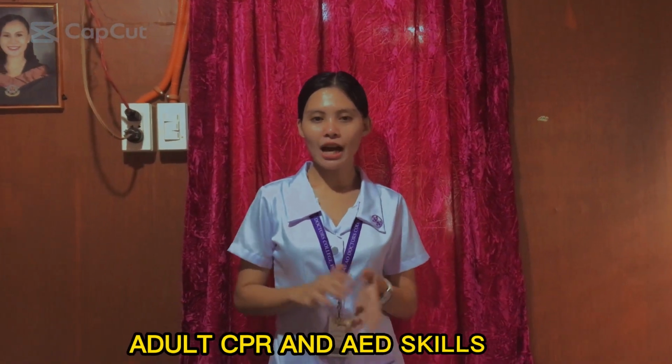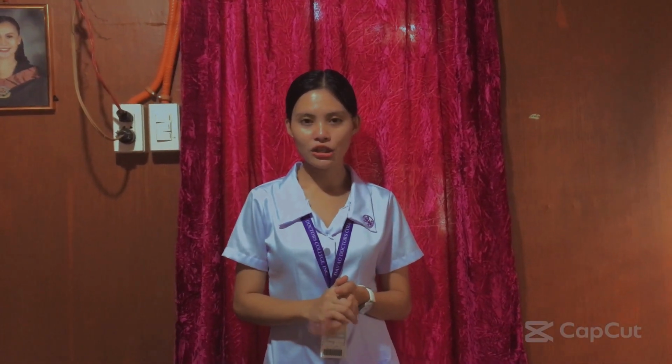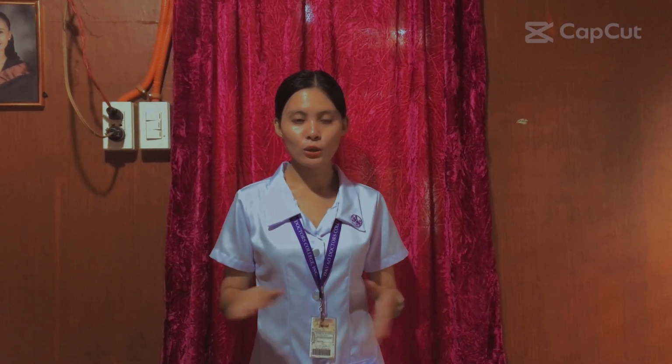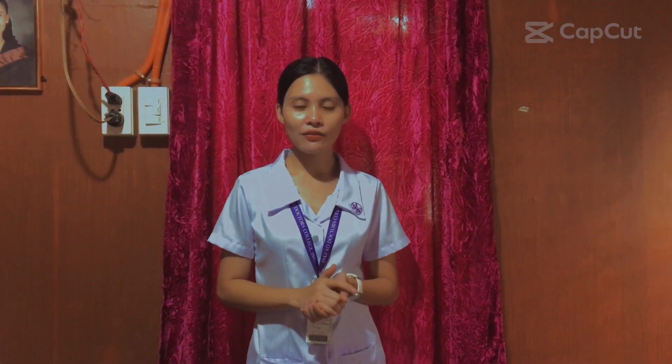Now I'm going to do the adult cardiopulmonary resuscitation and of course the AED skills. So prior to performing the procedure, I am going to activate our assessment. Let's assume that I arrive at the scene and I see the patient lying and appearing unconscious. The first thing I'm going to do is check the safety of the scene. I'm going to check the environment to see if there are any hazards that can aggravate the patient's condition and can harm me as well. If it is clear and there's no hazard, we're going to do the next step.